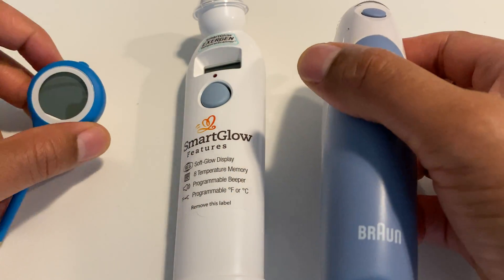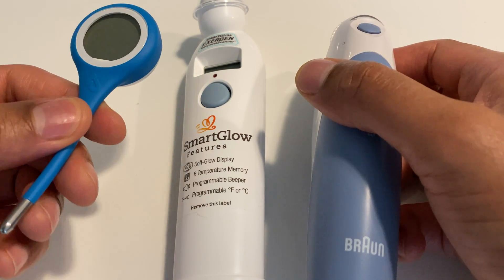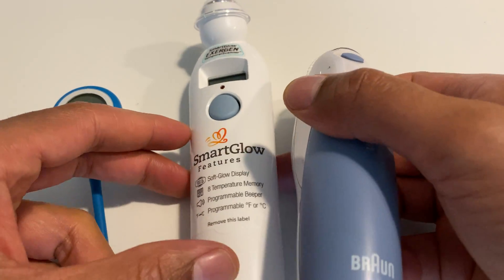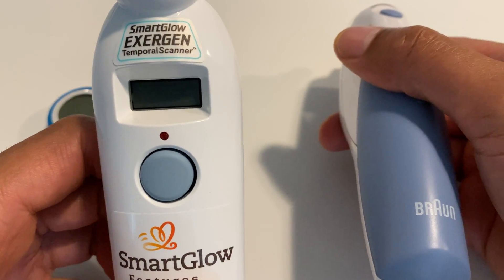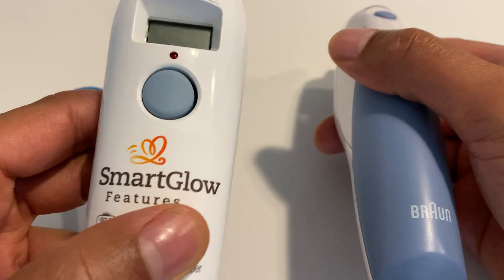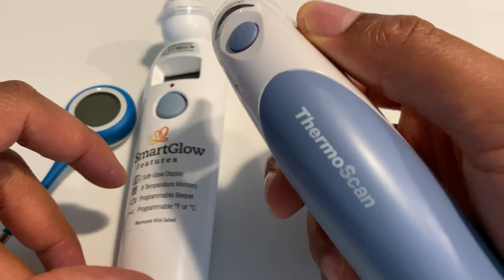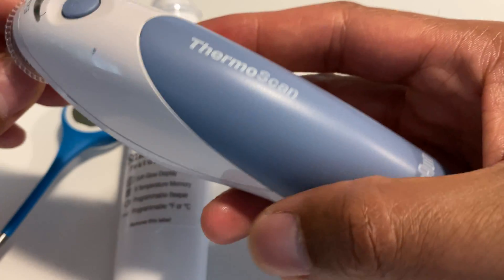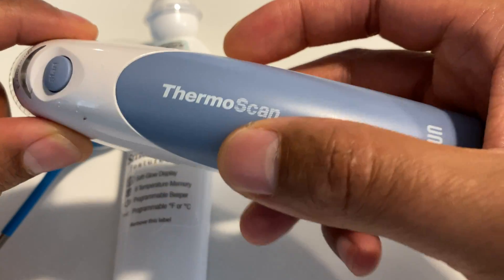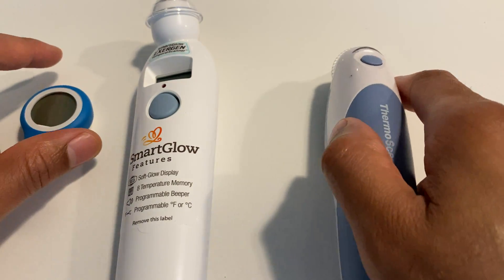So right here I have three thermometers. I have a fairly inexpensive thermometer called a Kenza Quick Care thermometer. Then I have the Smart Glow Exogen Temporal Scanner. And then in my right hand I have the wildly popular Braun ThermoScan. So let's talk about all of these.